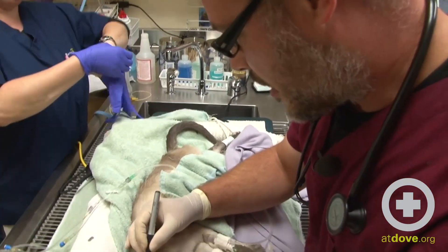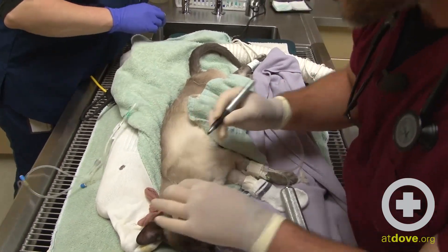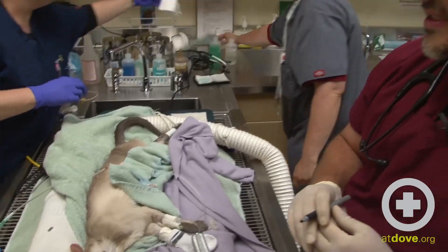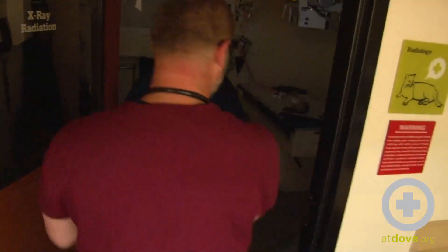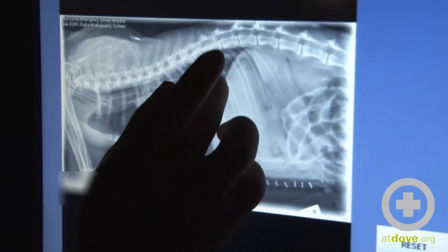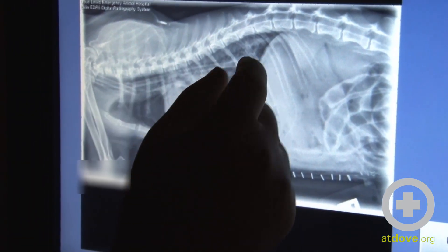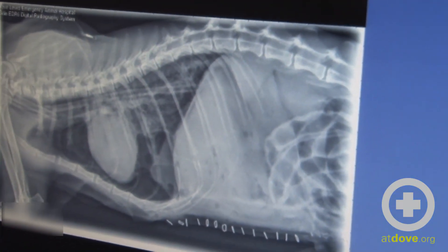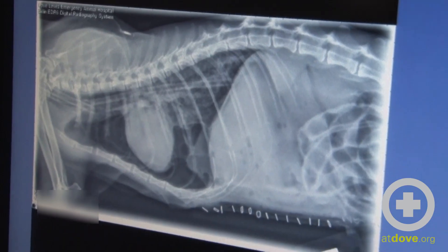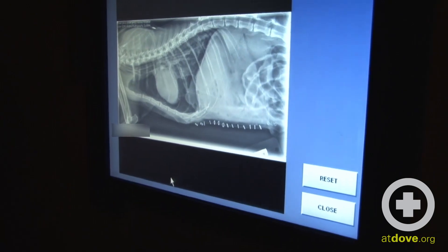We're placing a mark on the e-tube, because we're going to take an x-ray to confirm the position and see how far we need to push it in or pull it out. We want the tube roughly halfway between the heart and the diaphragm. As you can see, it's a little bit too far in, so we pull it out a small amount. The tube is now right between the diaphragm and the caudal part of the heart, which is the perfect positioning.